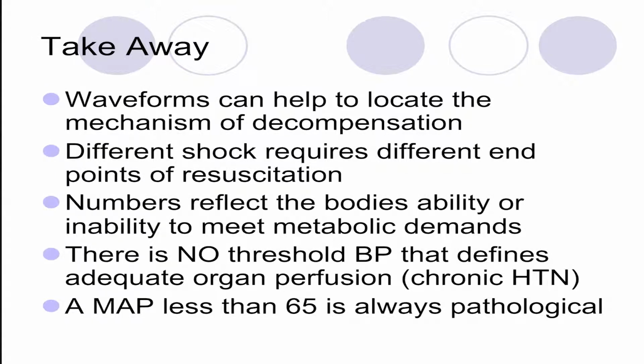So what to take away from this? Waveforms help locate mechanisms of decompensation. It's not just about a single number. You have a tool at your disposal to find out so many things about a patient that we underutilize. Especially if you're spending multiple nights with a patient, days with a patient, you can see changes. And we always think about really invasive measures like Swans giving us more information than this, but if we're looking at our CVP and art line waveforms, you can really tell what's going on with a patient.